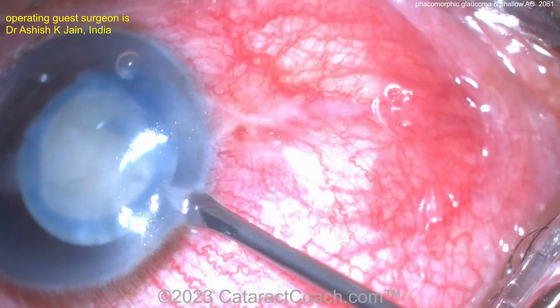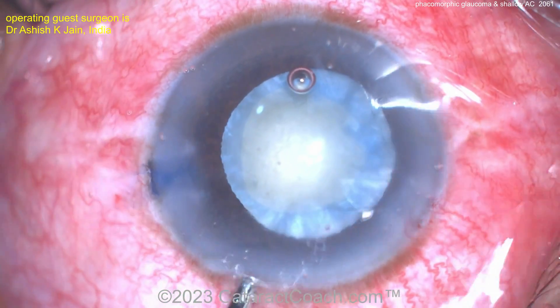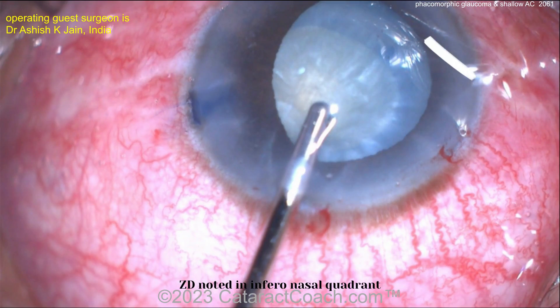There's the rhexis — it looks a little small for my taste, but probably okay. Here's another paracentesis, and here's the main incision. Just using an irrigator to get out as much of that fluid as you can.